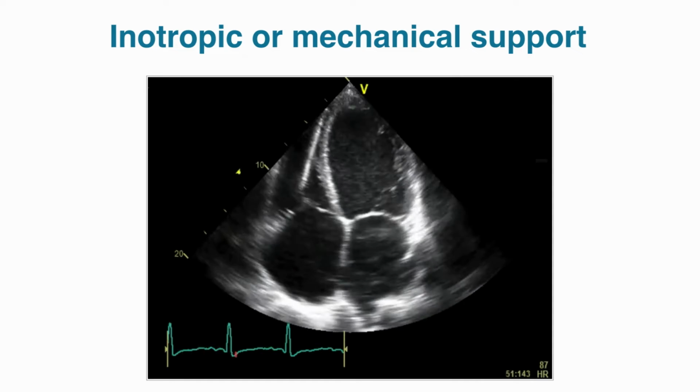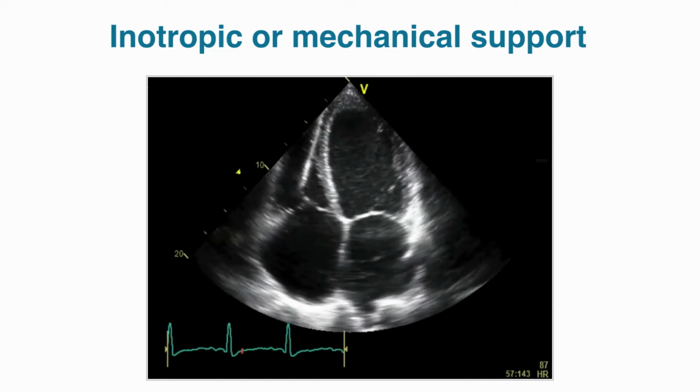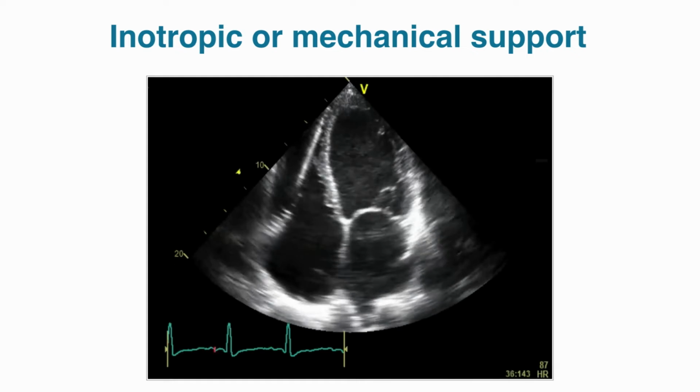In this example of a typical myocardial infarction, if you look closely, you will see not only a global impairment and dilatation of the left ventricle, but a complete akinetic apical segment as well. So what about this patient? He had a blood pressure of 70/40 and very poor left ventricle function. Does he also have hypovolemia?